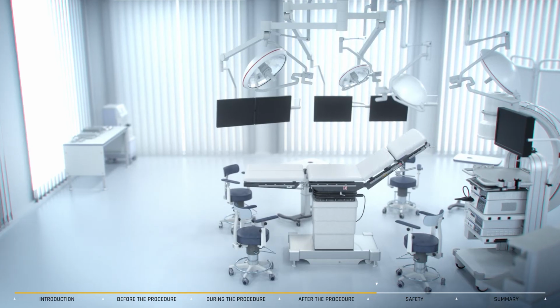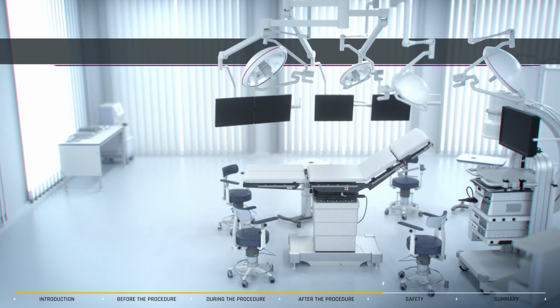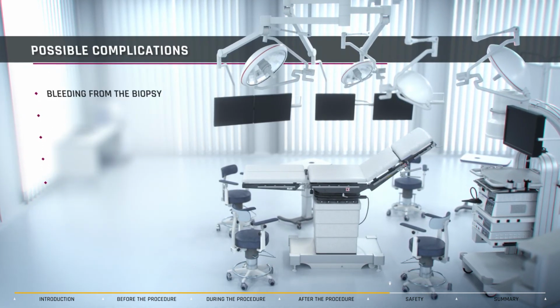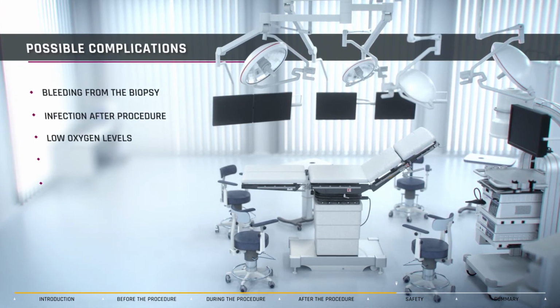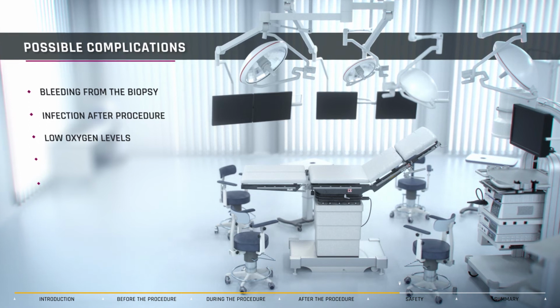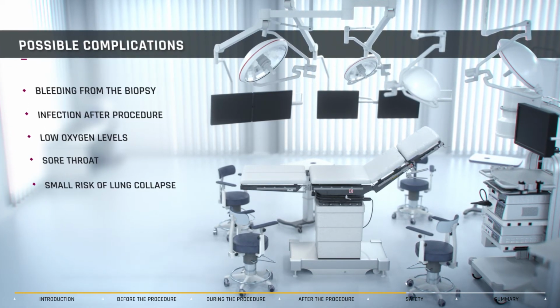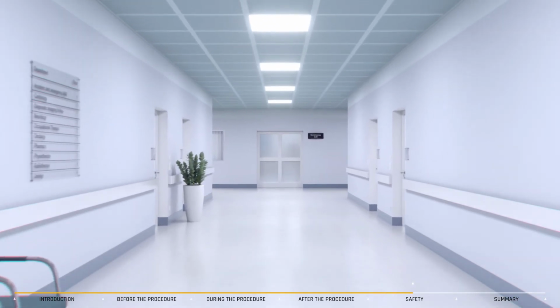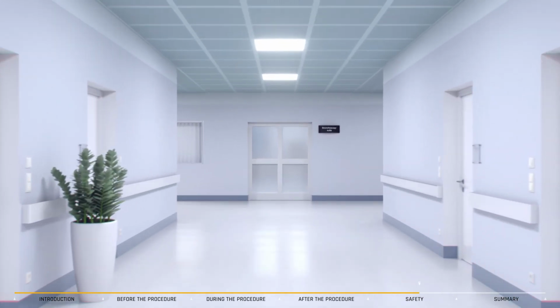EBUS is an effective procedure, but as with any medical procedure, there is a small risk of complications, which may include bleeding from the biopsy, infection after the procedure, low oxygen levels during or after the procedure, a sore throat, and a very small risk of collapse of the lung. All these complications are treatable, but may require you to be briefly admitted to the hospital instead of going home the same day as your procedure.